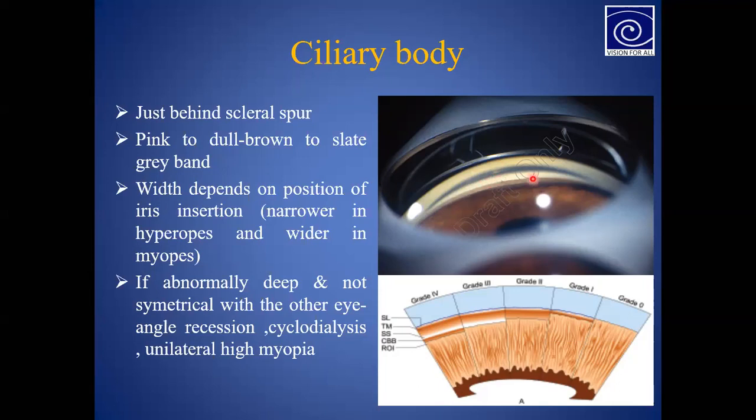So in this condition, in images like this, we cannot differentiate whether this is anterior pigmented trabecular meshwork or posterior trabecular meshwork. So we will consider it as a posterior trabecular meshwork, because the posterior trabecular meshwork will have dense pigmentation. So this will be considered as a posterior trabecular meshwork only.